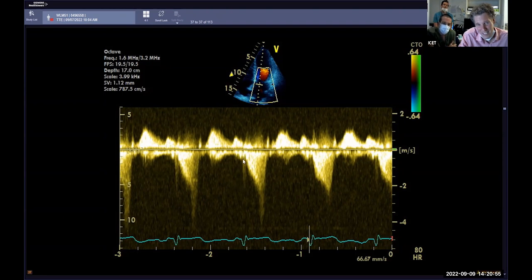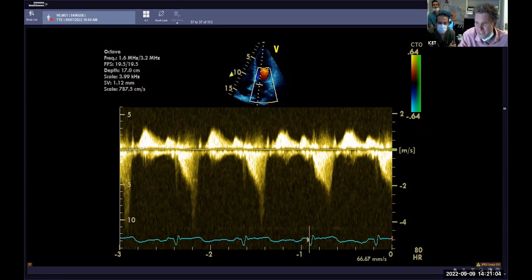I mean, I think there's a tiny little sniff of a signal in there, and then the next one, there's almost another profile in there. Can everyone see that? Does that make sense to guys online? Yeah. So it's all about the timing, how to differentiate between the LVOT obstruction from the MR. So mitral valve, and we love asking about this in the exam for anyone doing the DDU. MR will start first and end last.